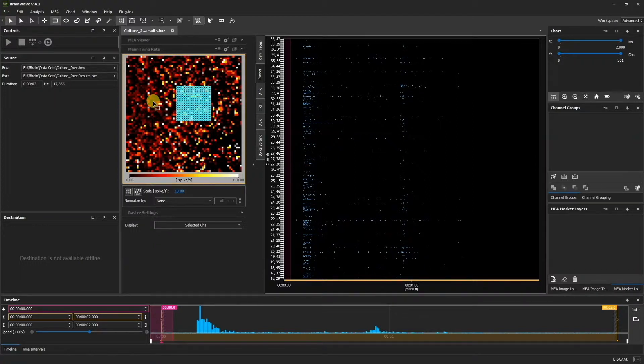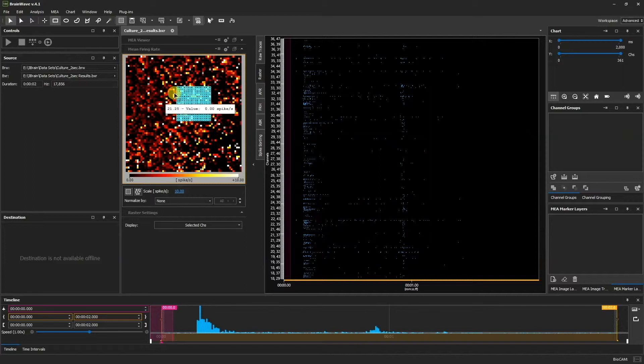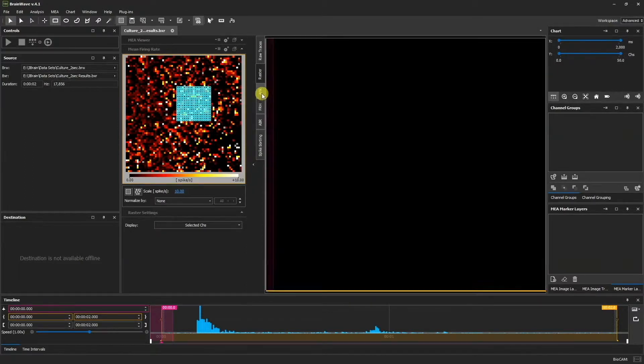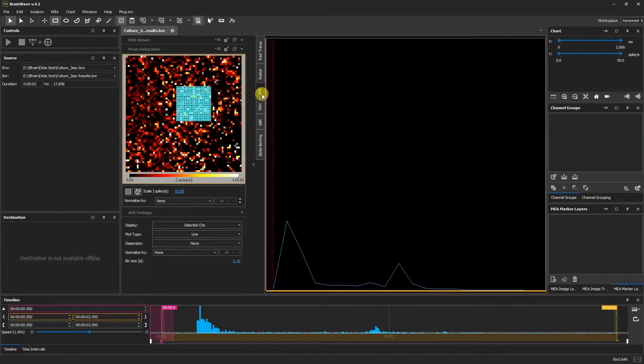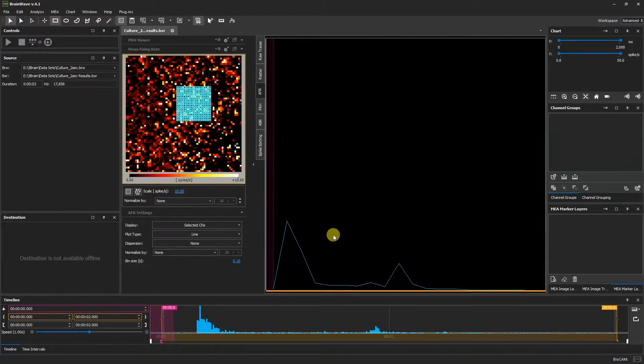Furthermore, we can see the average firing rate by clicking the AFR tab. Represented in the Charts window is the average firing rate for the selected group of electrodes.